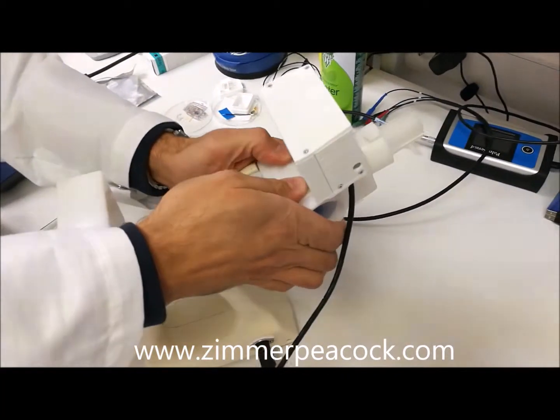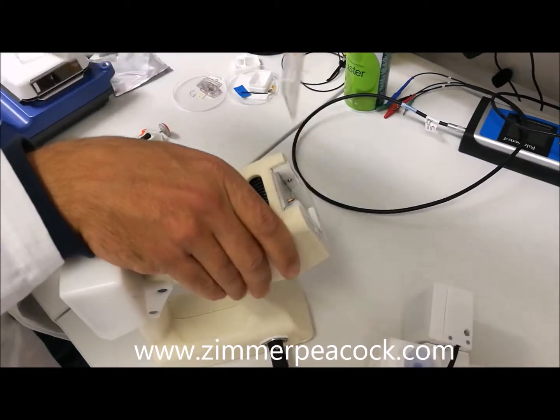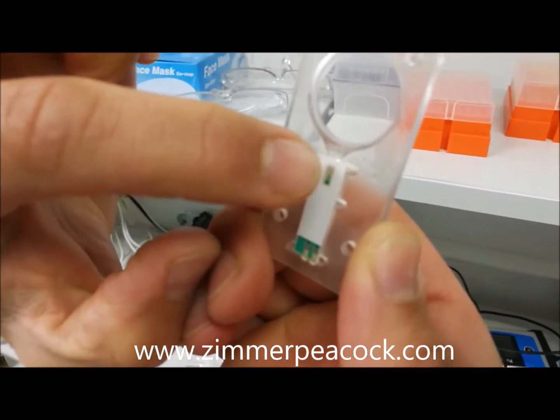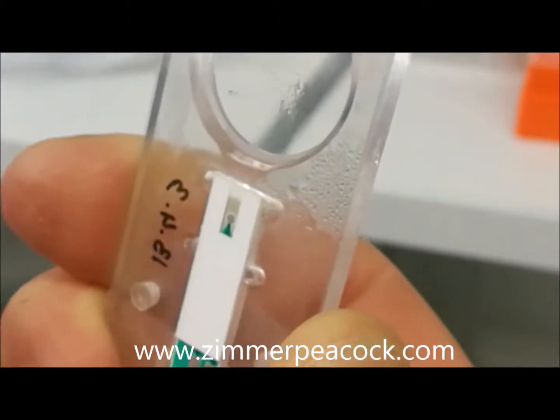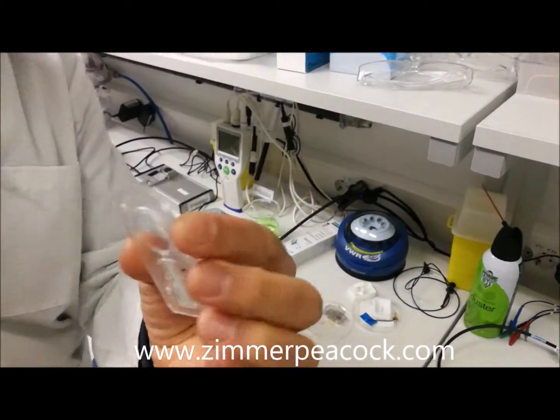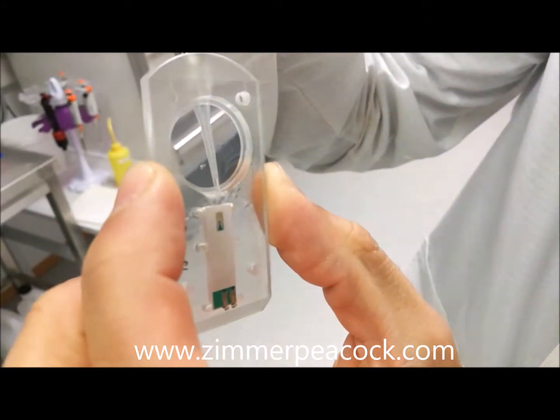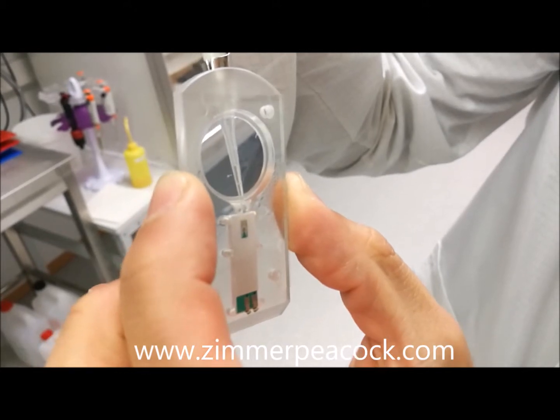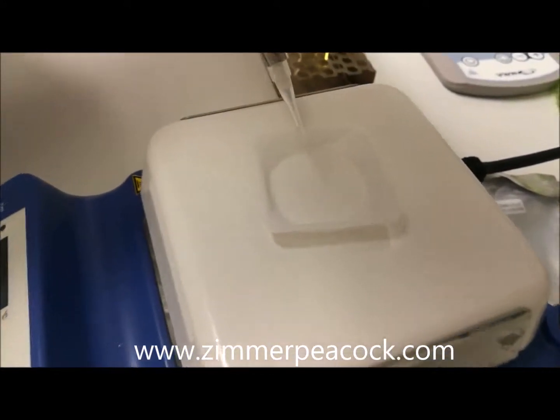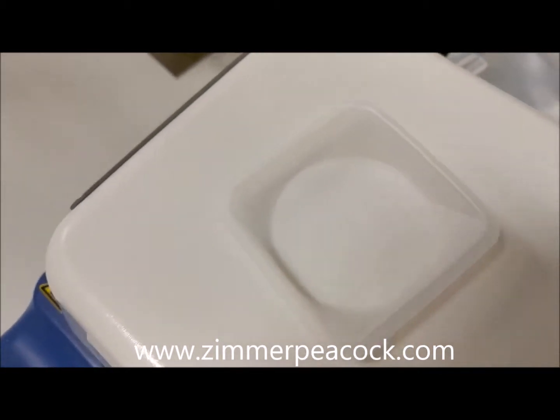I'm going to remove the sensor cartridge, and you can see that liquid has been collected — this is the condensed exhaled breath. I'm going to pipette this. With a pipette tip I'm pipetting about four to five microliters and I'm going to dispense it into this beaker.